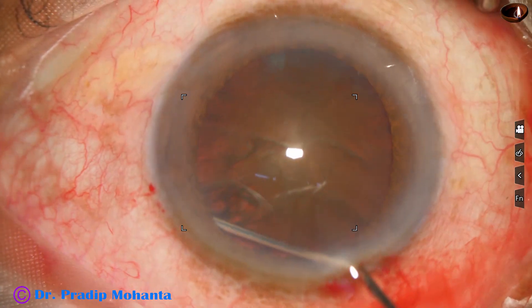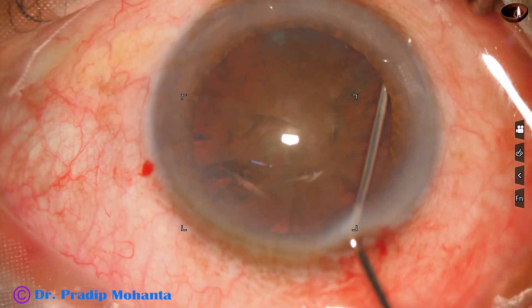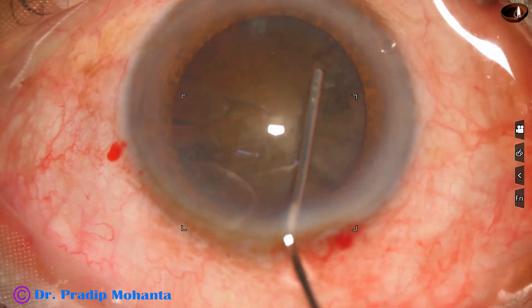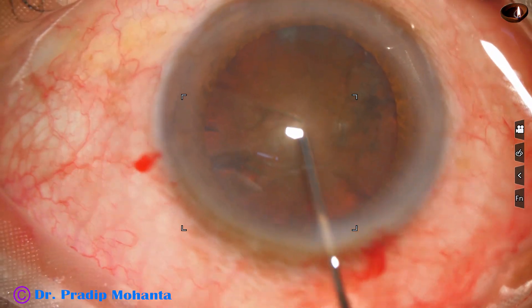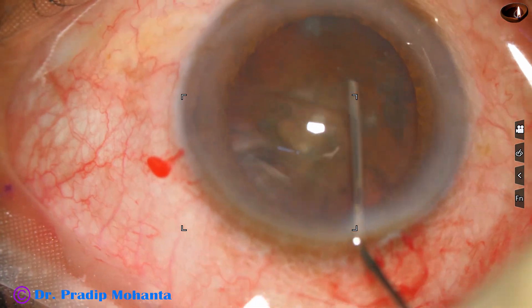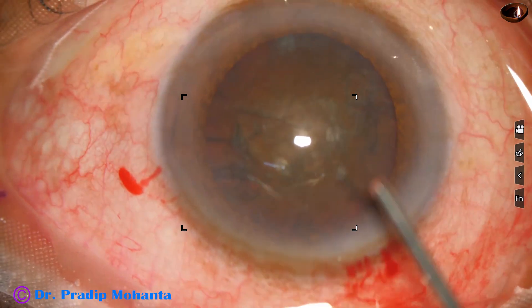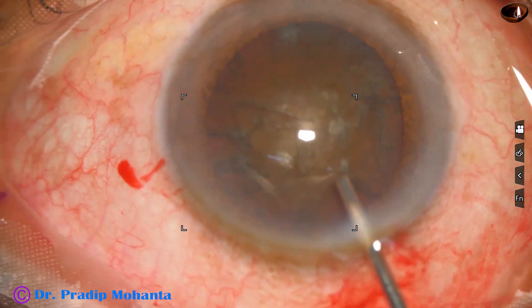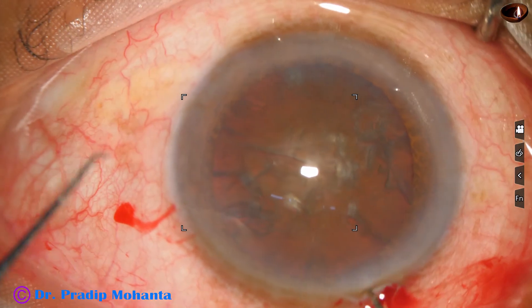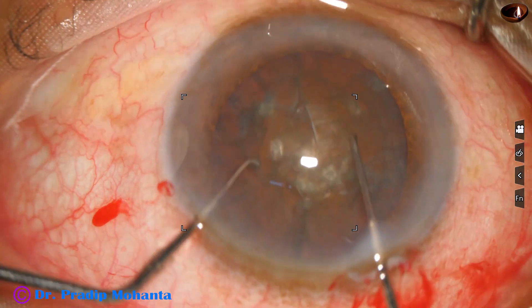And now hydrodissection. Hydrodissection is done at multiple points with small aliquots of BSS. And now I gently tap the nucleus and mobilize the nucleus. Then I inject some visco.